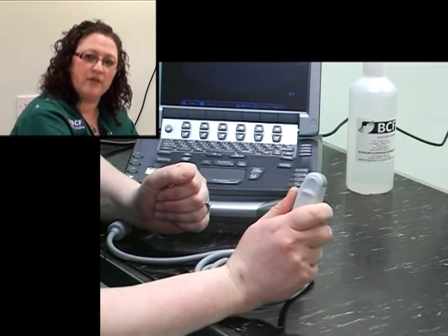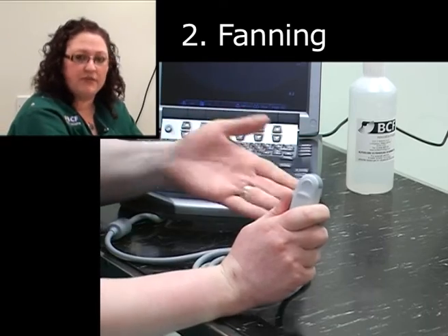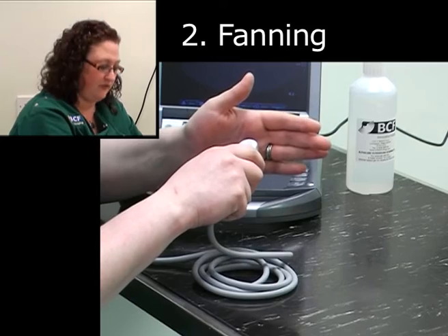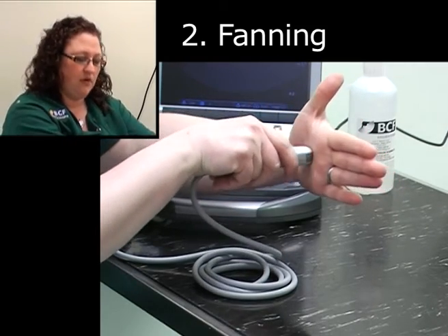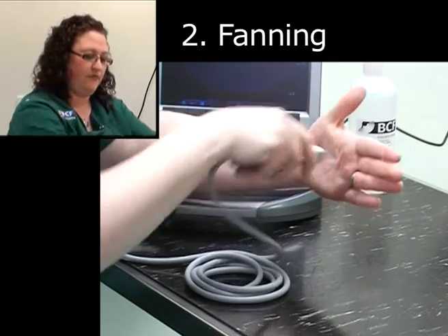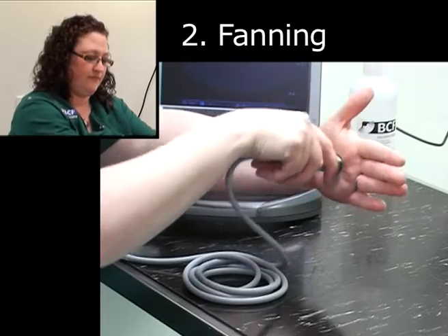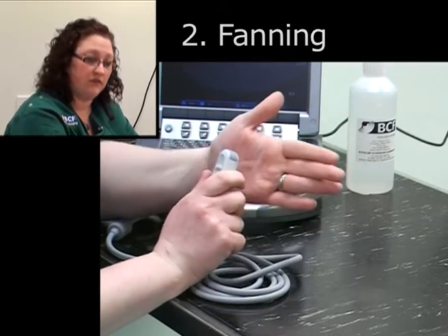The second movement is called fanning, and this is at a 90 degree angle to the rocking motion just described. In fanning, the probe is placed on the patient and you fan up and fan down. You'll notice that the probe doesn't actually move along the patient at all.